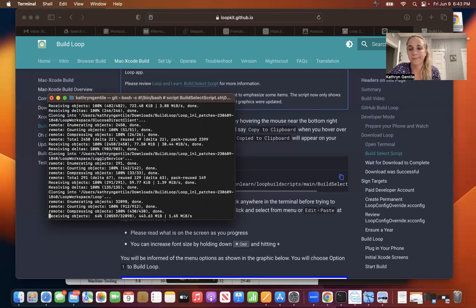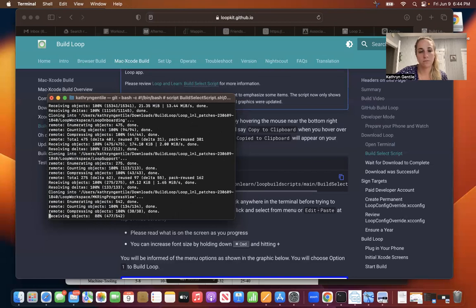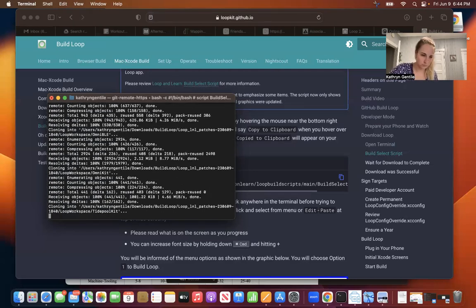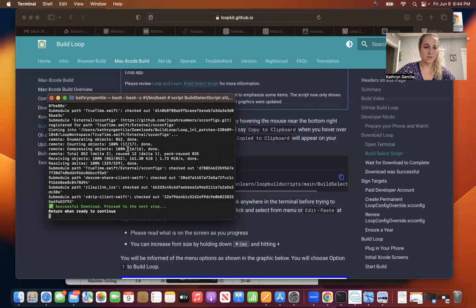How long this takes really just depends on how new your computer is, how much space it has. Some people it'll go super duper quick, others it might be really, really slow. It's definitely moving. Almost there. Okay, so now we are ready to continue and hit return.